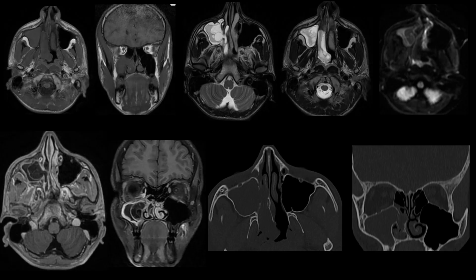MRI was done, showing a T1 iso-intense and T2 heterogeneously hyper-intense lobulated polypoidal lesion occupying the right maxillary sinus, extending medially into the right nasal cavity through the widened maxillary ostium. On T2-weighted imaging, a stalk is seen at the level of the maxillary ostium, and the lesion is extending into the posterior nasopharynx through the choana.